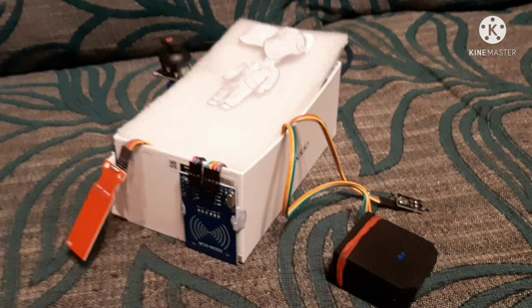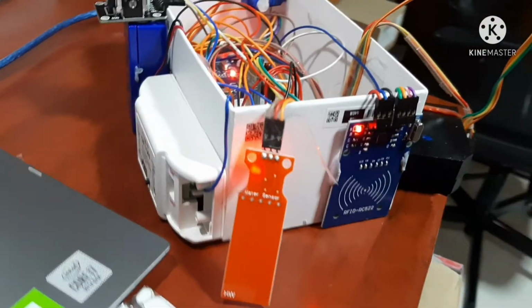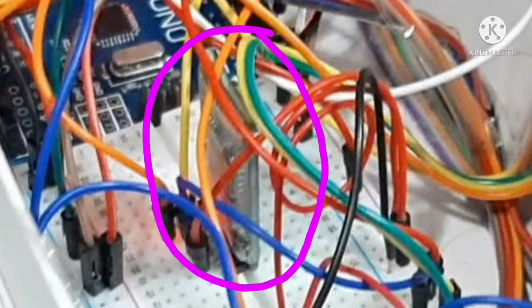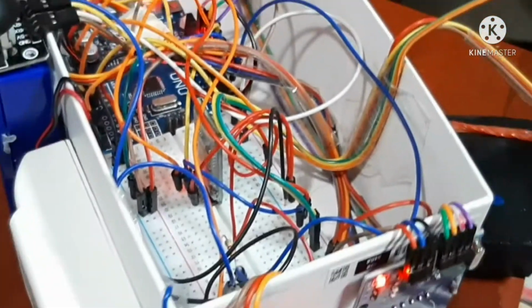On the inside of the bed, there is a Bluetooth device which sends data to Raspberry Pi B, as in B for Bluetooth. This is the interior wiring of the patient's bed, where you can see the master Bluetooth device and the servo motor which pushes the bed frame.